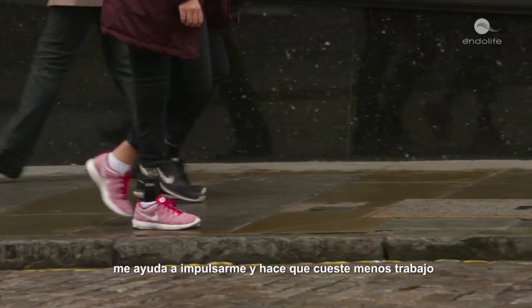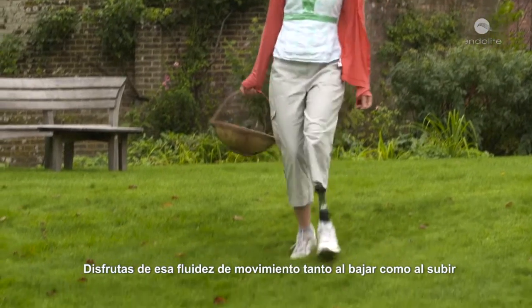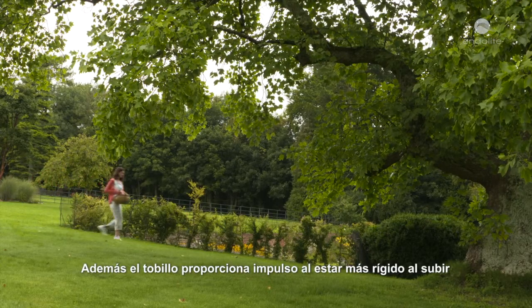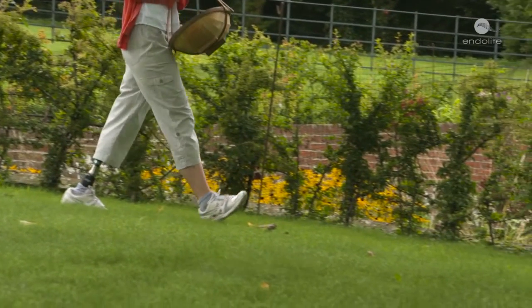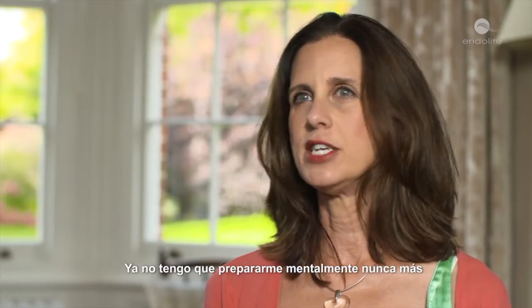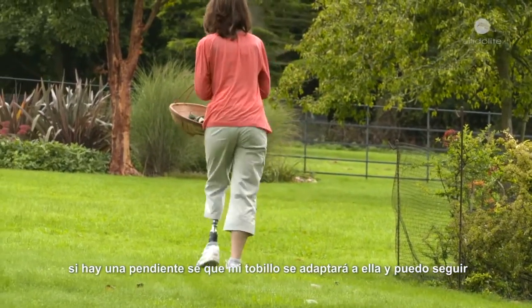It helps propel me up and makes it a lot less effort. Because you have that fluidity of movement when going down and also when going up, plus the boost from the ankle being stiff when going up and looser when going down, it's a much more natural movement. I don't have to do that mental preparation anymore — there's a slope, I know my ankle can accommodate it, and you just keep going.